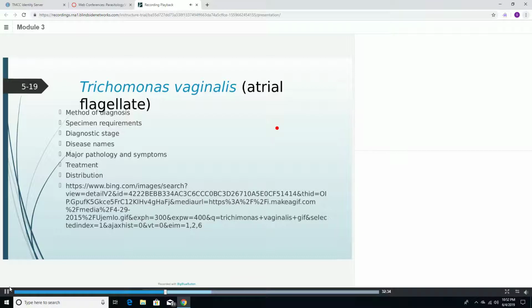But when we're looking for Trichomonas vaginalis, Trichomonas hominis may be noticed. So it's really important that we take the time to identify these organisms. And the book also mentions that we want to take special care when examining specimens from children, because it could be indicative of child abuse.